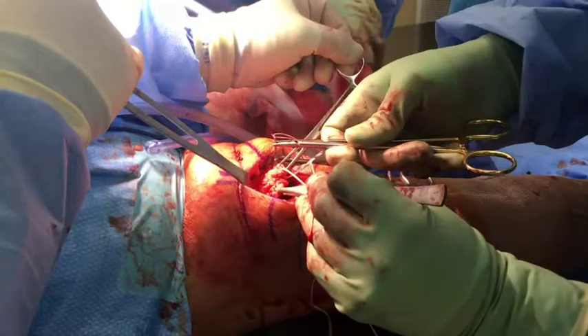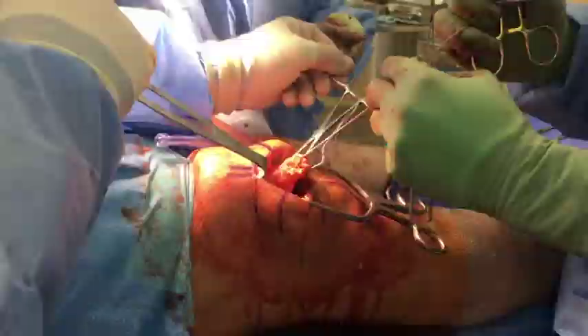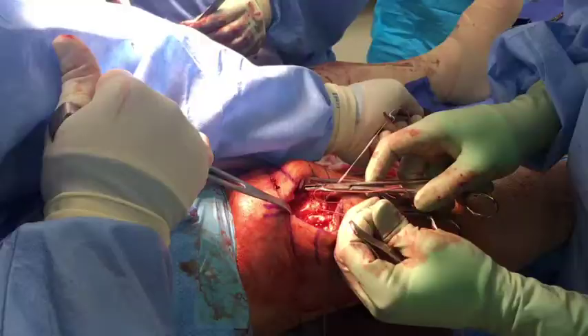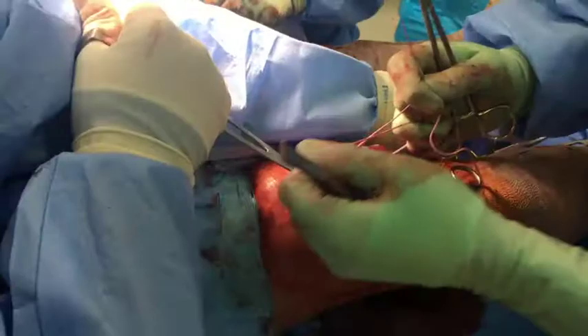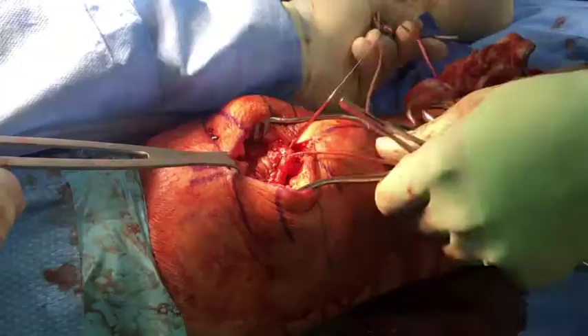We then secure the tendon using a running locking Krackow suture with five throws proximally and five throws distally. It is critical to remove all of the slack throughout the entire construct with every pass of the suture. The final pass is taken out through the torn edge of the tendon near the first suture.